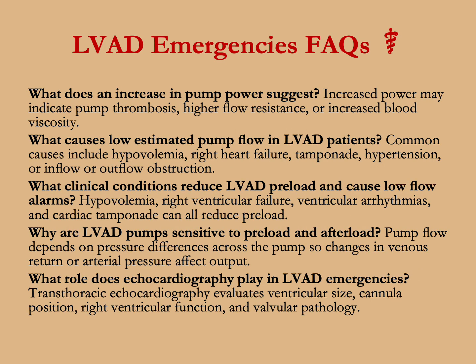What does an increase in pump power suggest? Increased power may indicate pump thrombosis, high flow resistance, or increased blood viscosity. What causes low estimated pump flow in LVAD patients? Common causes include hypovolemia, right heart failure, cardiac tamponade, hypertension, or inflow or outflow obstruction.